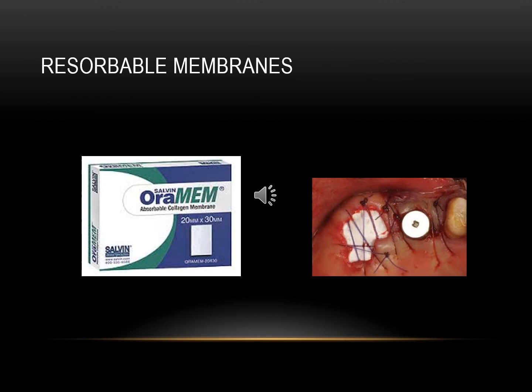In this picture, you can see the resorbable membrane, it's a collagen membrane, covering the bone graft. There is a suture over the membrane and the graft to prevent any movement of the graft and the membrane during the healing period.